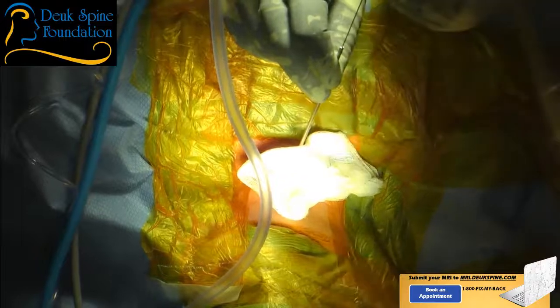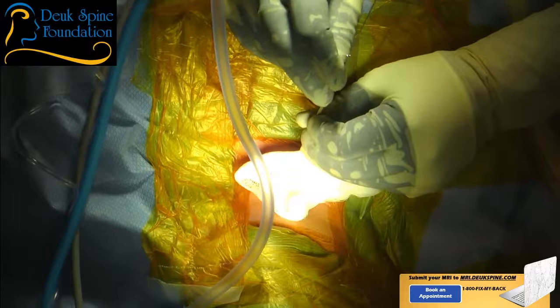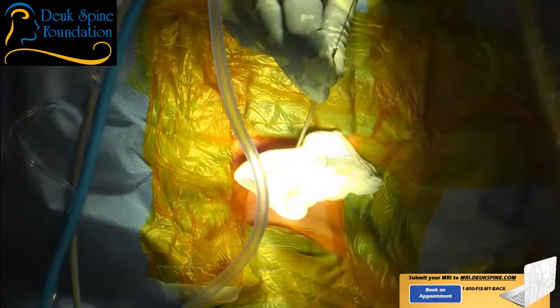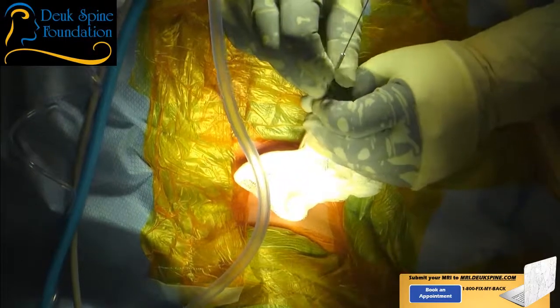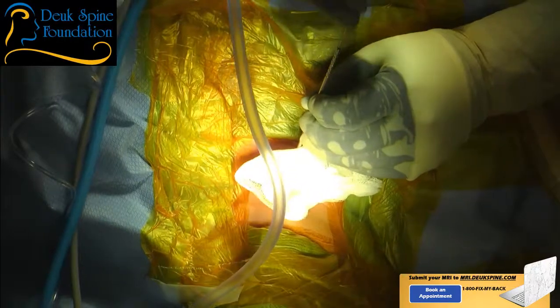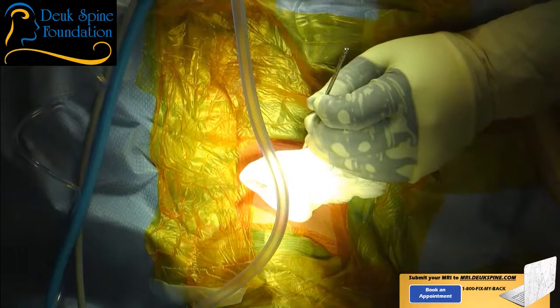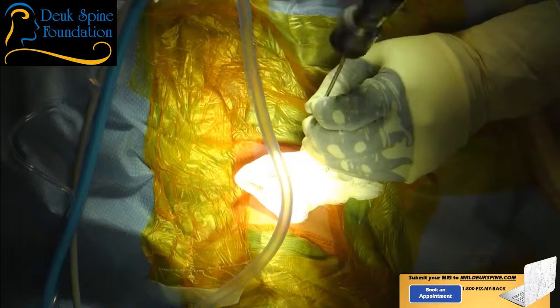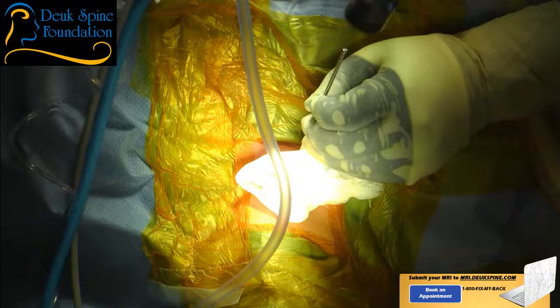I'm pushing and twisting, which is the proper method. Of course, I developed the method. So that is the proper method. I'm encountering a little bit of resistance. Now, I am embedded in the disc at this point in the anterior annulus, so I'm going to take the guide wire out so we don't risk doing something stupid with it. And I'm going to go ahead and do what everybody loves to watch, banging a hammer with a piece of metal over somebody's spinal cord.